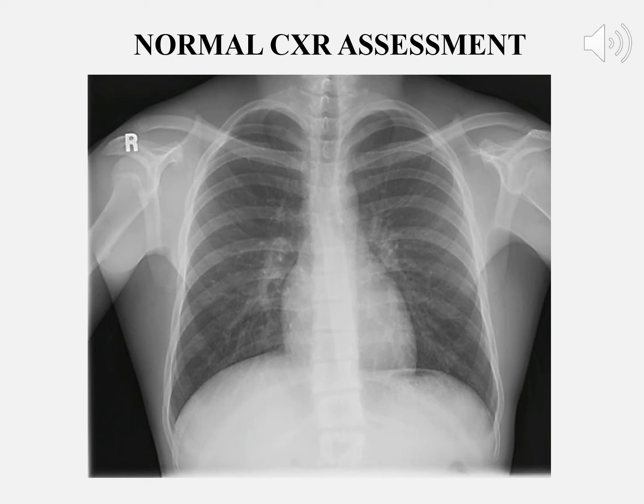So look at it. This class is just an introduction. It's not meant to overwhelm you. You certainly won't be highly proficient at reading X-rays if you weren't going into this class. This is an introduction to X-ray interpretation, to chest X-ray interpretation. But as you go on in your studies and as you go on in your career, you will become more and more proficient at this. And so realize that when you're done and you're graduated and you're practicing and you're looking at an X-ray, you are responsible for everything on that image.